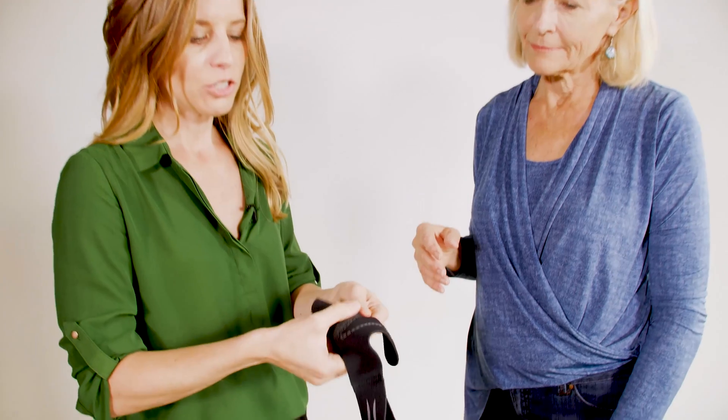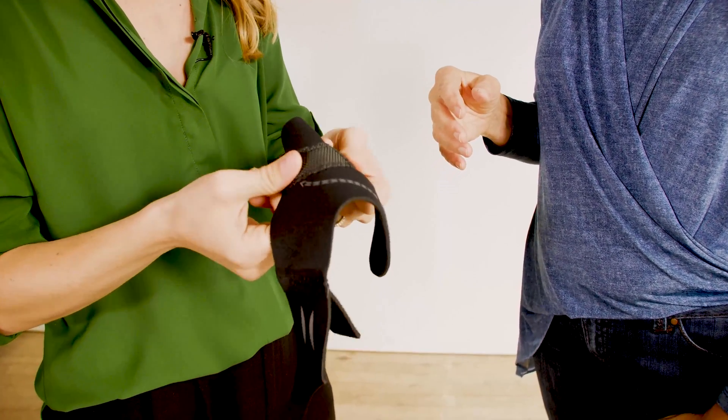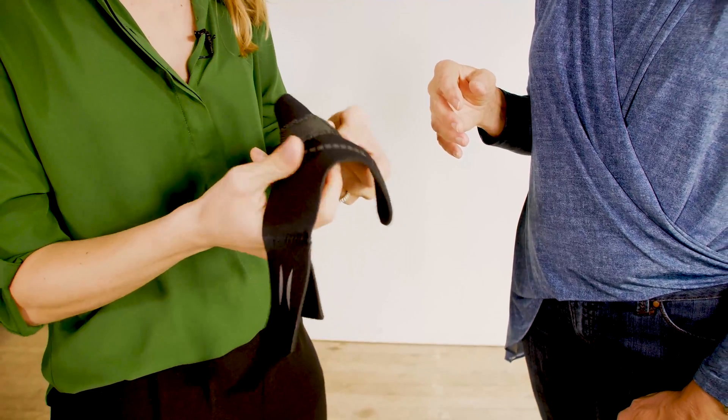When you take the product out of the box, make sure that your stay is nice and smooth, opened up into a nice natural arc. You don't want to have any sharp corners from packaging.